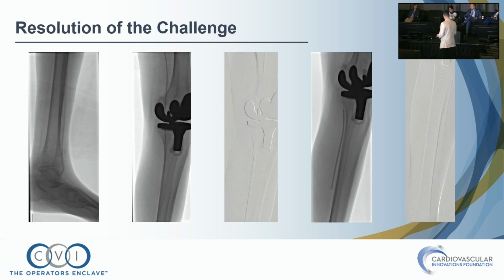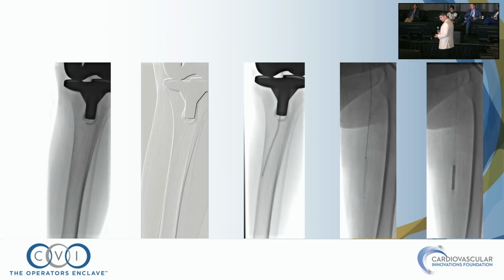I was debating actually, should I leave it alone? Should I touch it? But I just felt the outflow is not good, and they have to take care of the SFA lesion. So I was worried everything was going to close up again. So we decided to attempt more thrombectomy, only in the TPT, not into the PT, because as you know, the device doesn't go in small vessels. So you can see in the left side panel, the tip of my aspiration catheter right below the prosthesis.